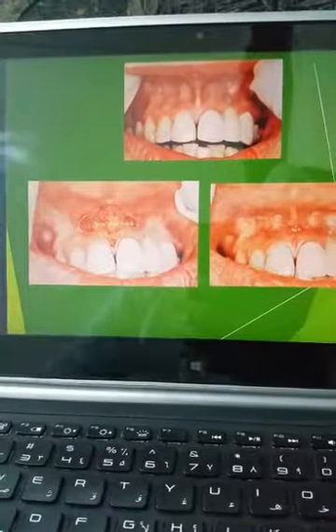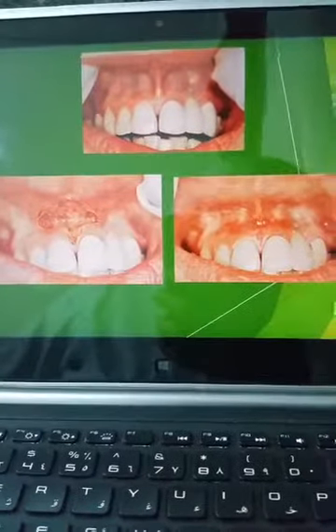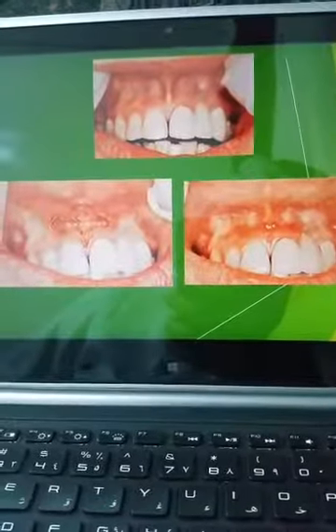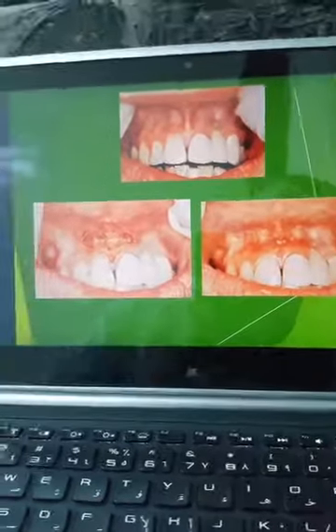A frenectomy with any type of laser is useful, but if you're applying the diode, you have to be parallel to the long axis of the tooth. Never ever direct the laser to the apices of the teeth, except if you are dealing with Er:YAG laser or CO2 laser.